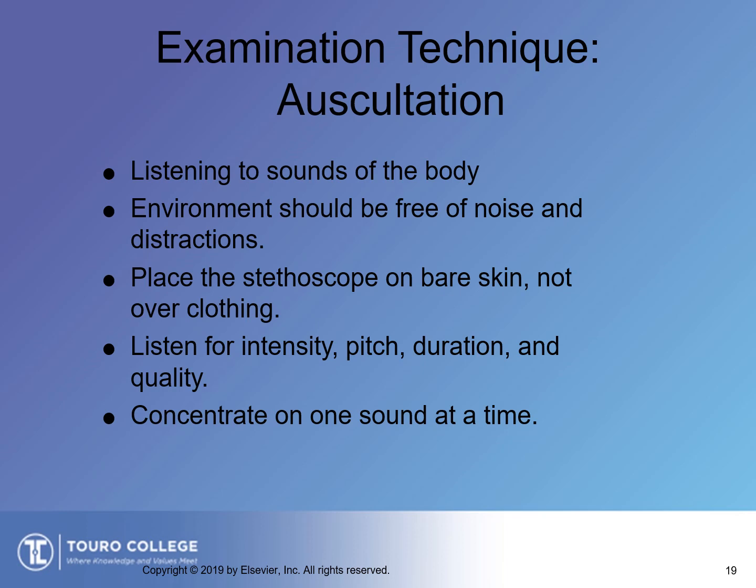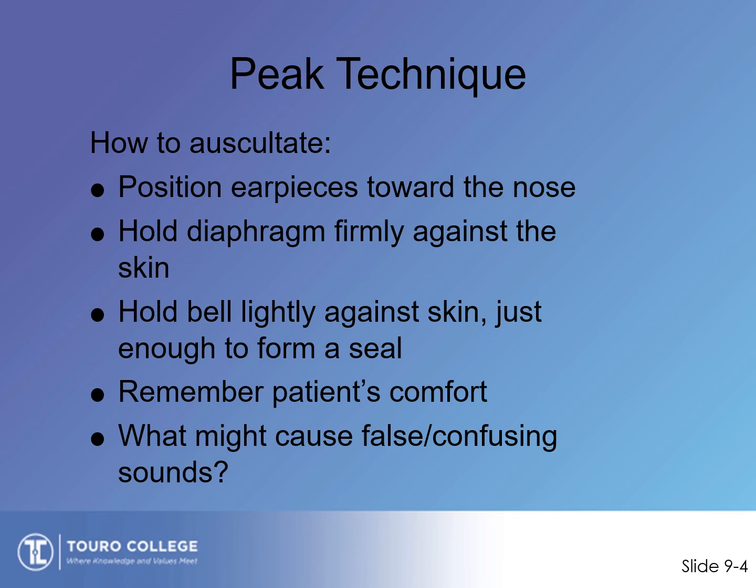Place a stethoscope on bare skin. Listen for the intensity, pitch, and the duration, also the quality. Concentrate on one sound at a time. So if you're listening to the heart and the lub-dub, lub-dub, I'm focusing on that lub first, and then I'll listen to the other.